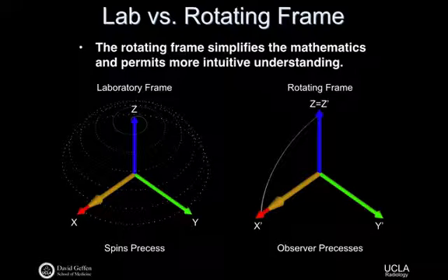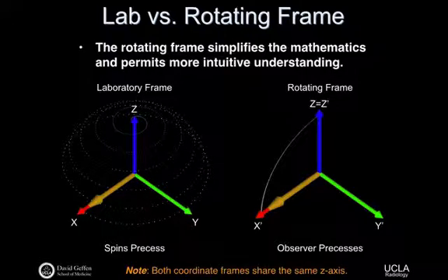So we can talk about the flip angle, how far it rotates. We can also talk about the phase. I can bring my bulk magnetization down along the x prime axis, or by manipulating my RF pulse, I could bring it down along my y prime axis. Why would you want to do that? We won't talk about that too much in this lecture. We'll just talk about how we can do that right now.